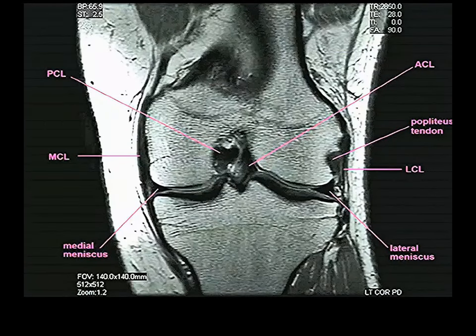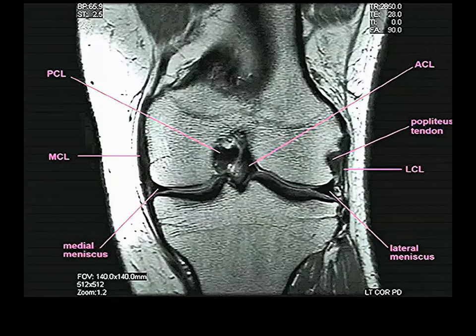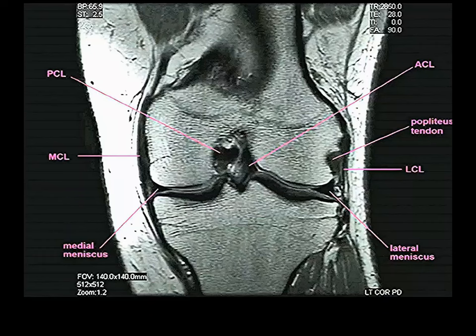Here is the coronal MRI showing the collateral ligaments. The medial collateral ligament is shown attached to the medial meniscus — the other component of the unhappy triad. The lateral collateral ligament is very far removed from the lateral meniscus. You can also see the popliteus tendon on the lateral side, and the separation of the collateral ligament from the lateral meniscus more clearly.